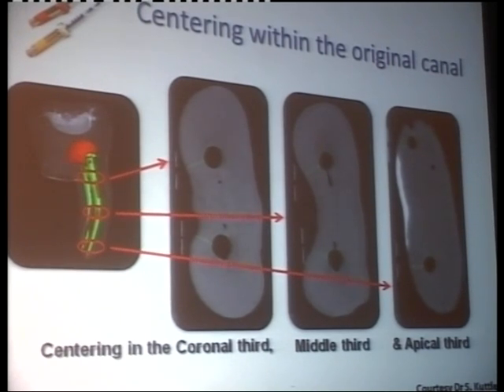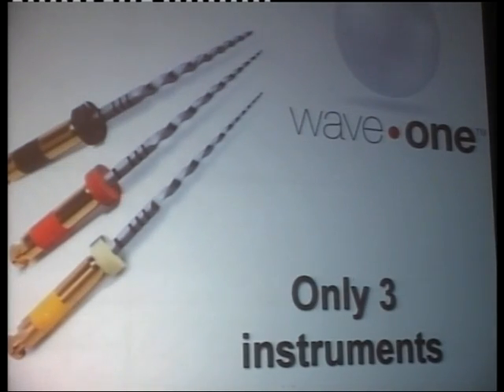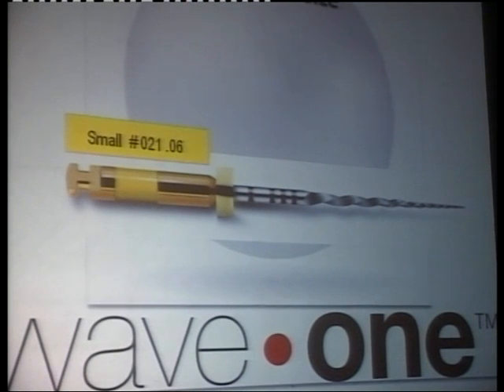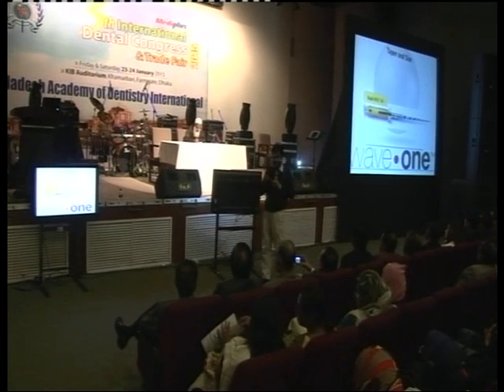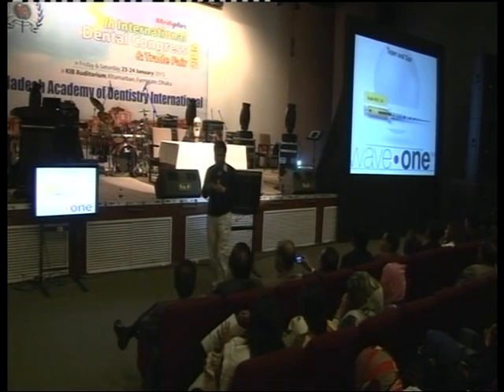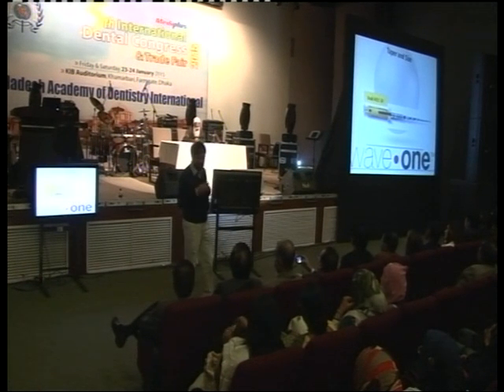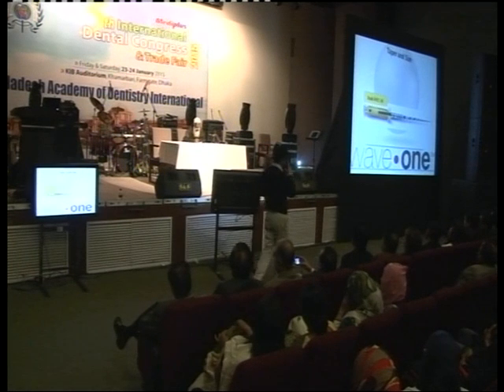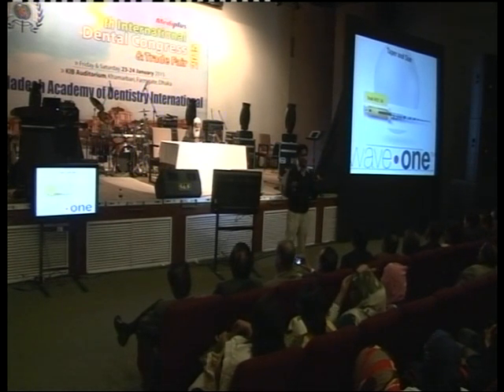That is what we need during root canal preparation. There are 3 files, which we have shown here. This is the small file. The small file is 6% taper, and the ISO number is 21. Usually we know the number is 20, but here they have changed it to 21. The tip diameter is 21, and the taper is 6%. With this file, you can prepare all the small canals with only one file.